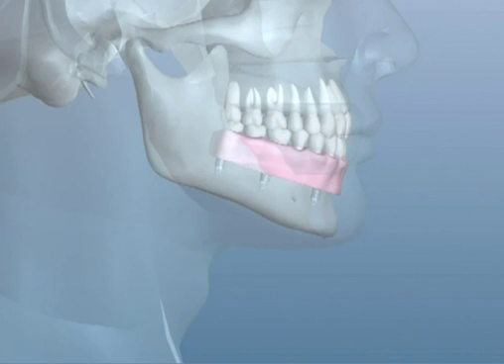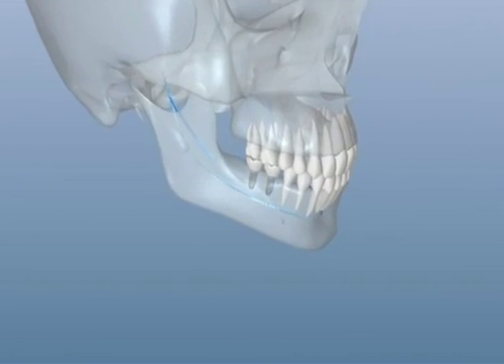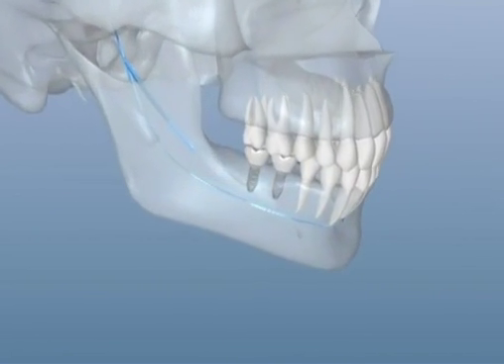Dental implants are artificial root replacement structures placed in the jawbone to provide support for dentures or as anchors for missing teeth. Implants are also used to replace one or two teeth so that a bridge may be placed. Or you can use the implant as a replacement for a tooth or teeth lost to trauma, such as a sports injury or motor vehicle accident.